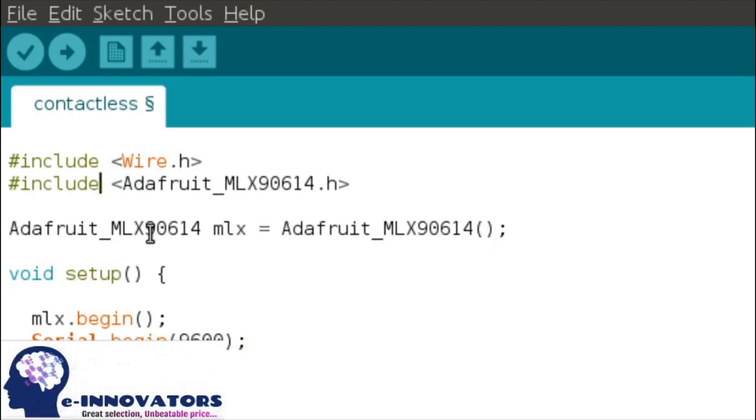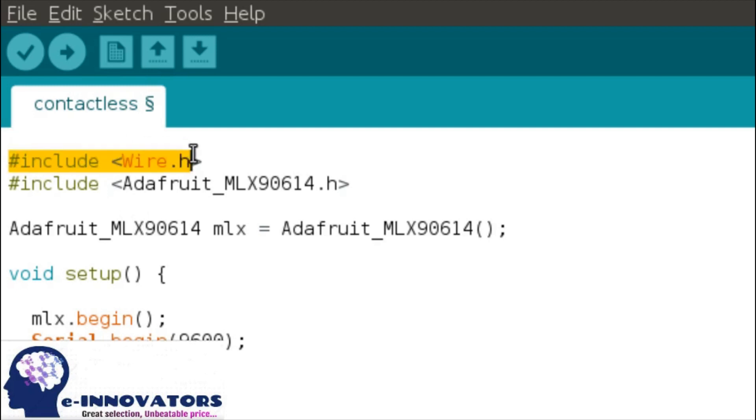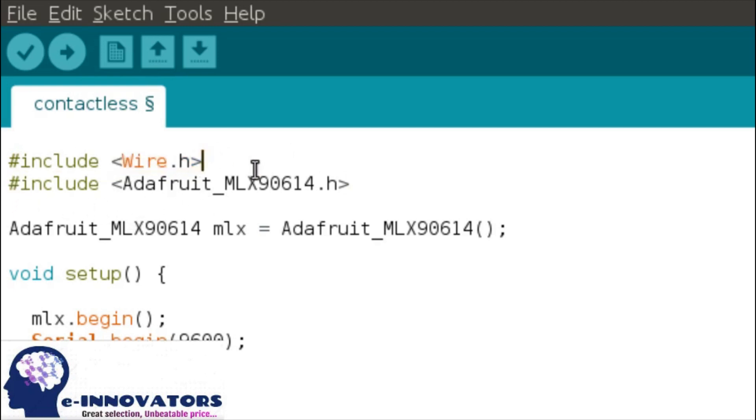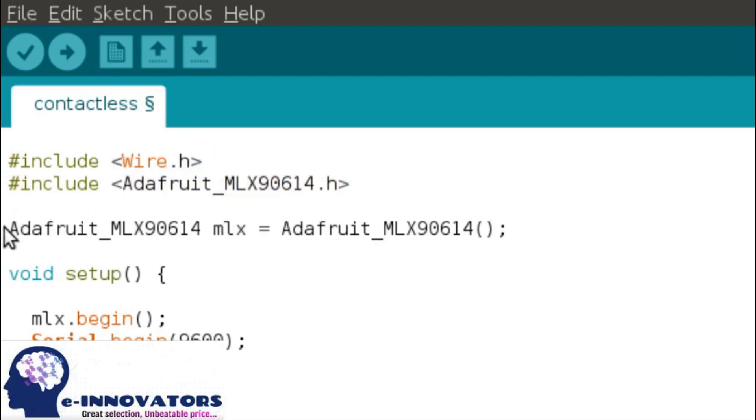Above the setup function, we have to include two libraries. First one is wire.h which is used for I2C communication protocol and other one is mlx90614 sensor. Firstly, we have declared the sensor as the variable.